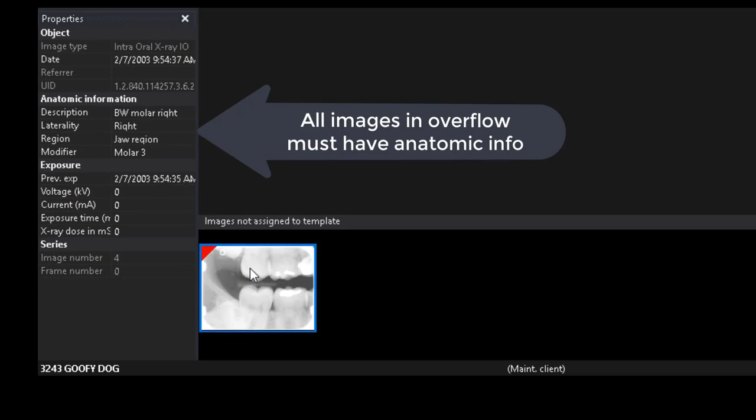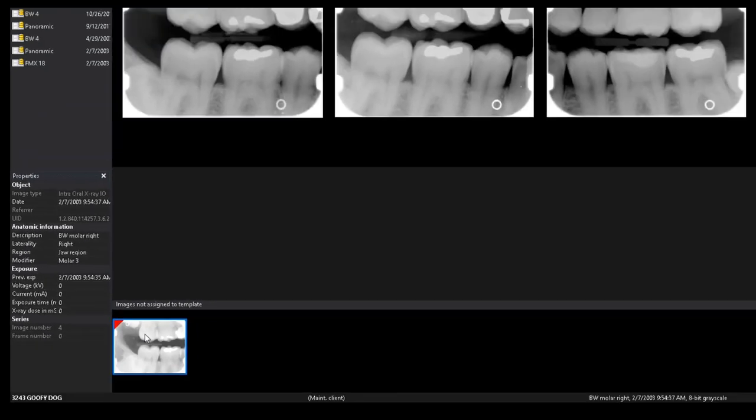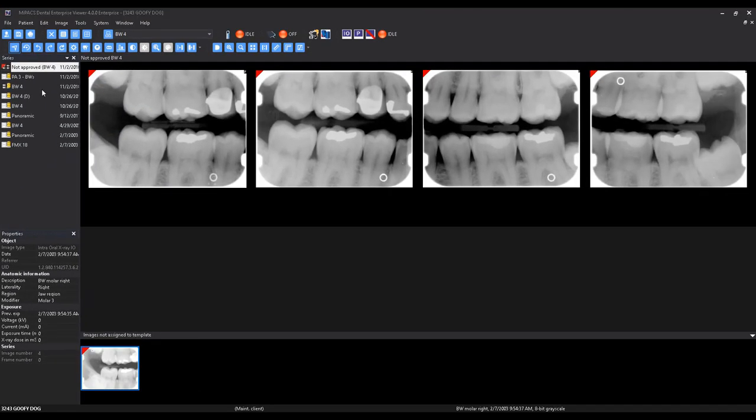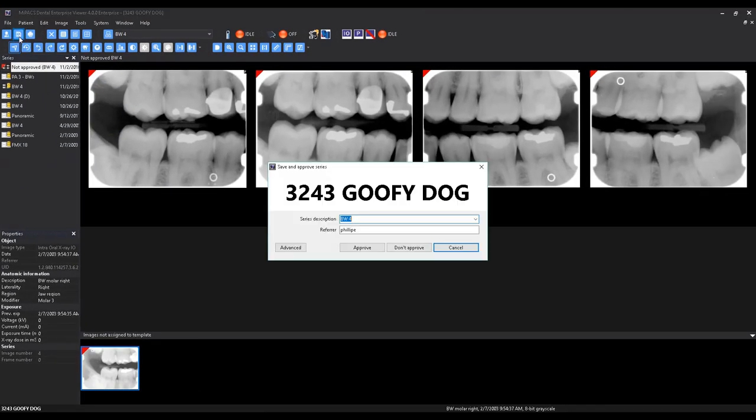Because of this, images in the overflow area must have their anatomic information specified in order for the entire series to save.